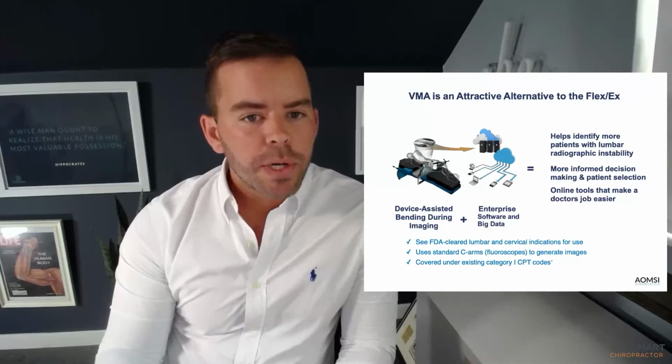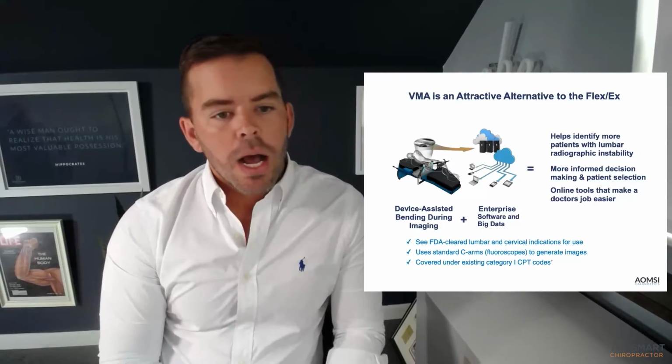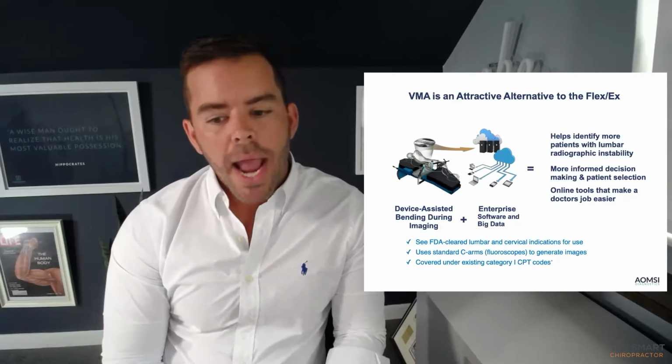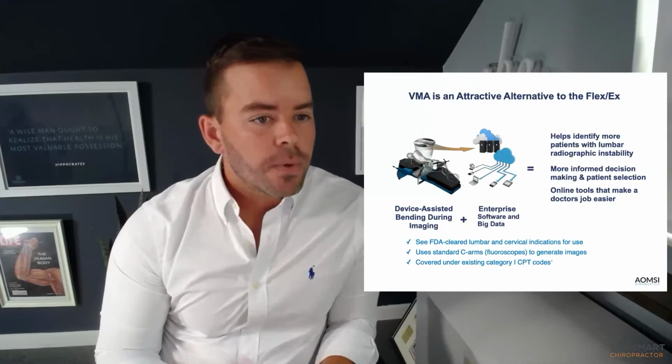So as we talk a little bit about an alternative to the flexion extension x-ray, as you can see here, the VMA actually will assist the patient through a full flexion and full extension.